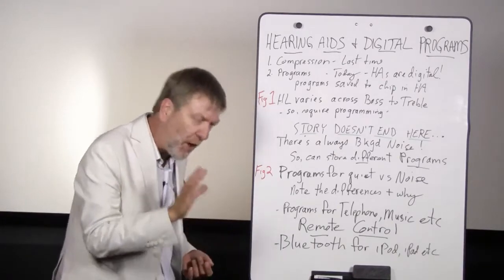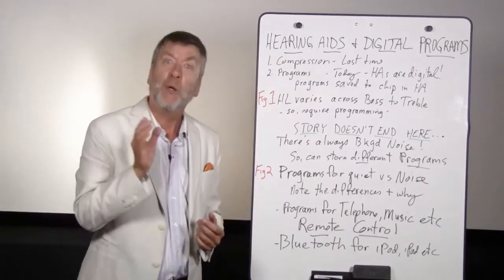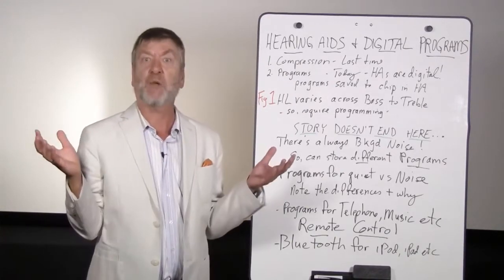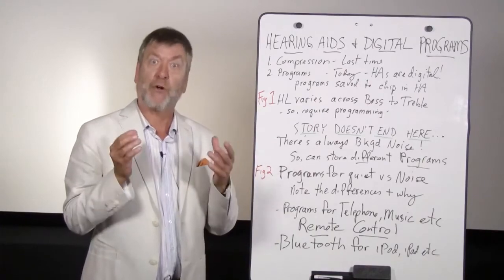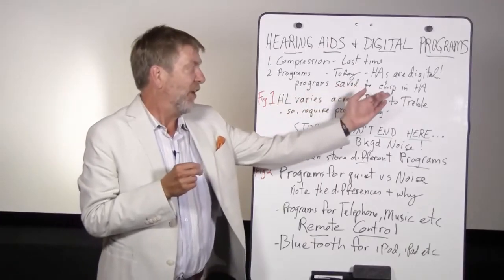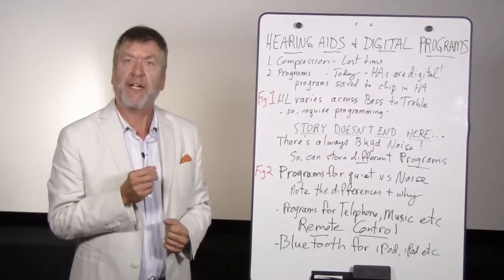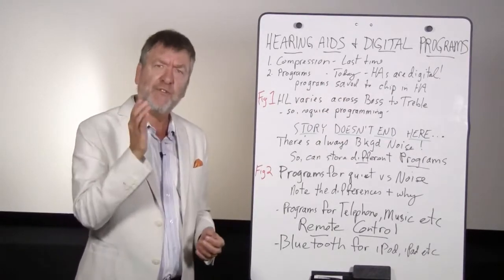Well, let's move beyond that topic today to talk about how hearing aids are programmed. And like any computer, they are no exception. The results are stored onto their digital chip. Today's hearing aids are all digital. Hearing aid programs are saved onto the chip inside the hearing aid. Why would that be necessary? Well, let's look at figure one.